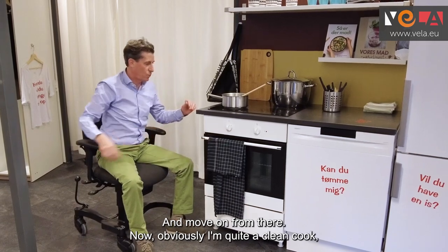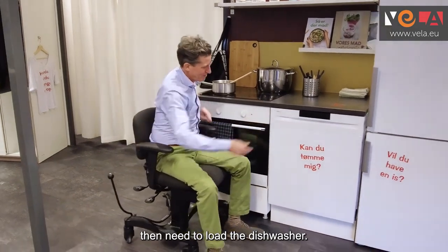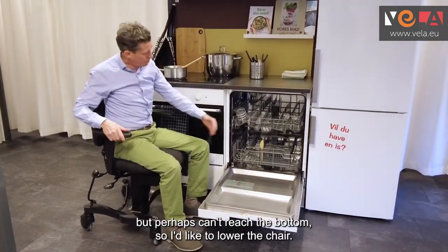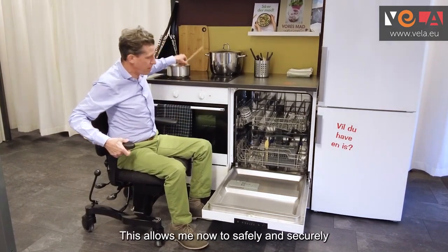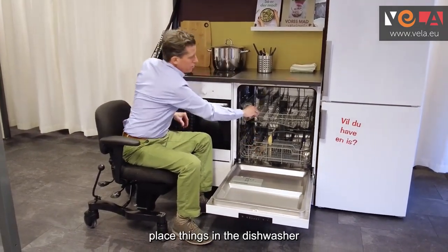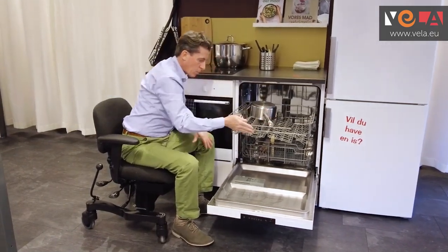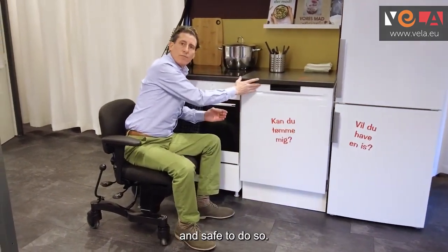Obviously I'm quite a clean cook, but afterwards we often need to load the dishwasher. I can open it nice and securely but perhaps can't reach the bottom, so I lower the chair. This allows me to safely and securely place things in the dishwasher without the fear of falling or slipping. It's extremely easy and safe to do so.